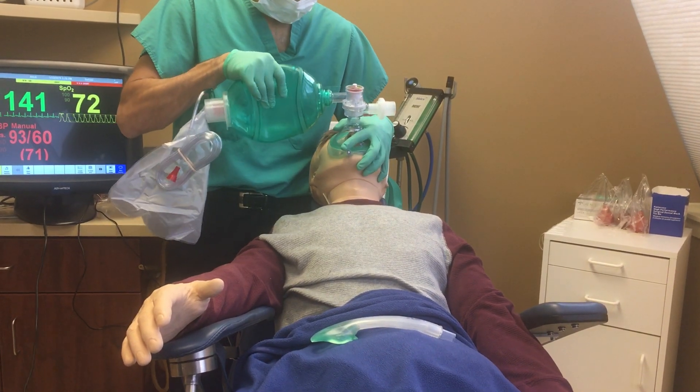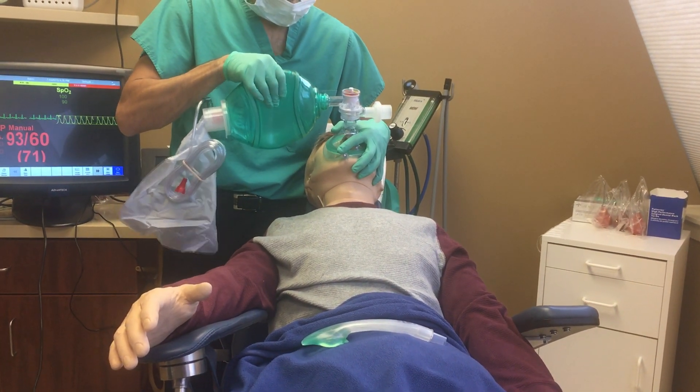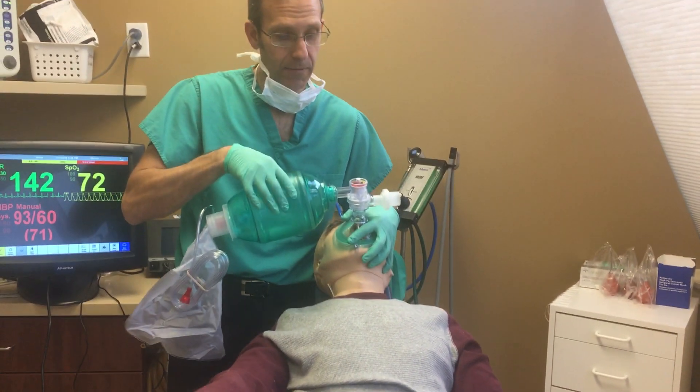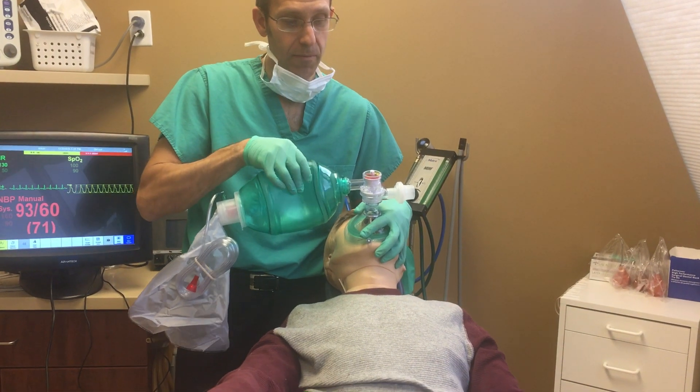Alright, I'm trying to ventilate. I'm not getting much chest rise. My oxygen saturation is low.